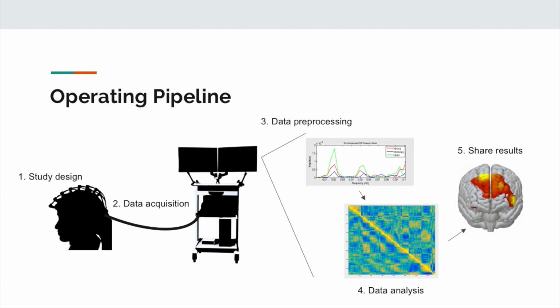Then there are other things to do. Sometimes there will be motion artifacts in your data still, so you want to use some algorithms to either ignore that data or smooth it out. Do things where you're isolating particular frequency bands of the signal that you care about and stuff like that. It's essentially all the stuff you do to clean the data before you then want to run the stats on it. The stats happen in the data analysis section.